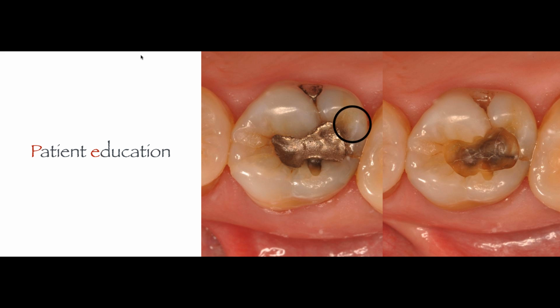And when the photo is blown up, now we can see that on the distal marginal ridge of that first molar, the patient has a crack, it's a fracture. We can see that there is a space in the center of that marginal ridge. So there's actually a real fracture in that portion. We don't know what the extent of the fracture is, but we know there's a fracture.